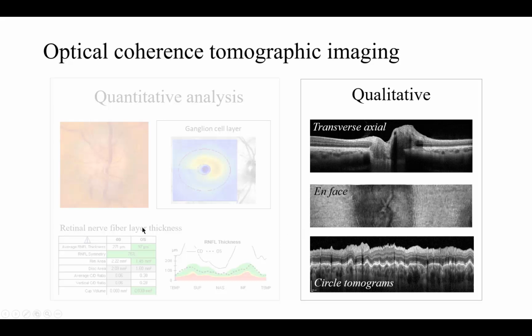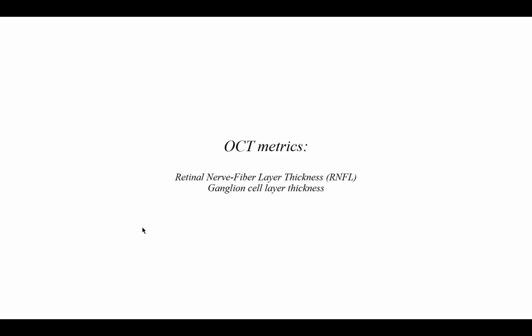these figures. The brevity of this introduction on metrics or quantitative OCT should not be interpreted to mean that this is unimportant. Quite the contrary. It's probably the most important aspect of the OCT analysis of the optic nerve. I just don't have enough time to cover everything in this one lecture, and it's a topic that's been extensively covered in the recent literature.